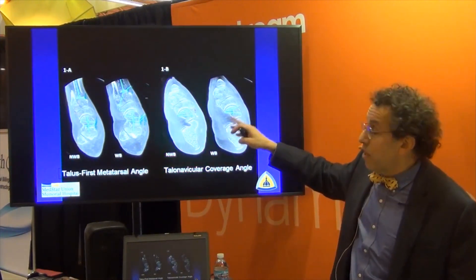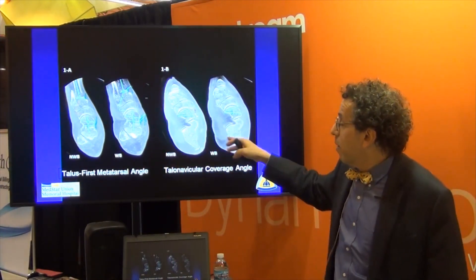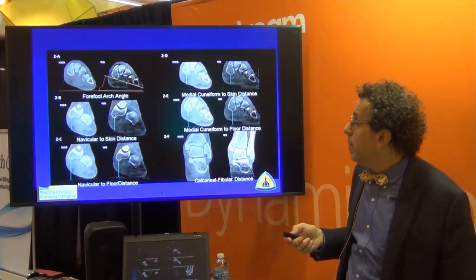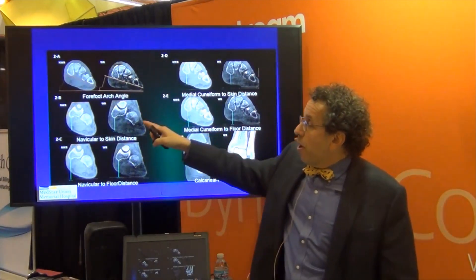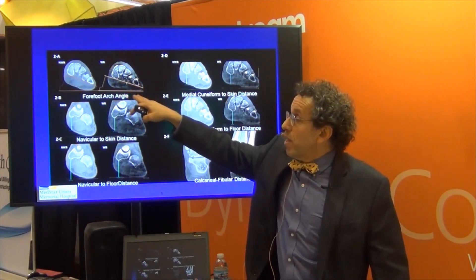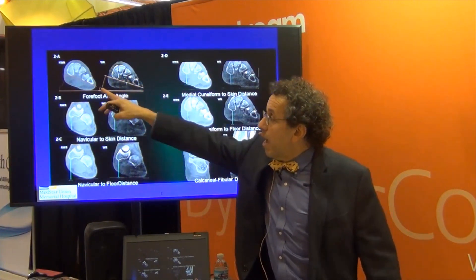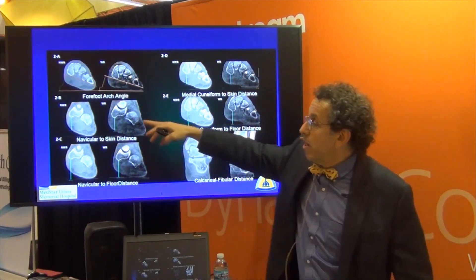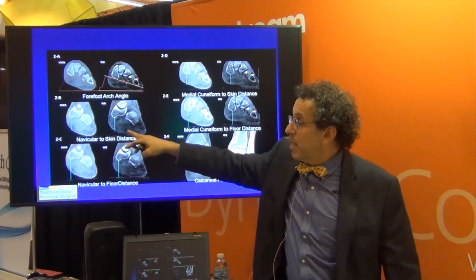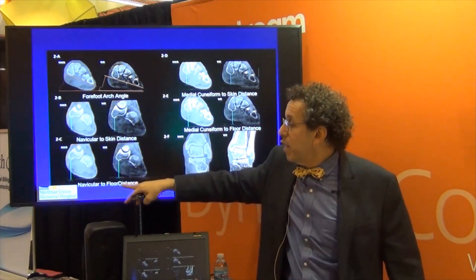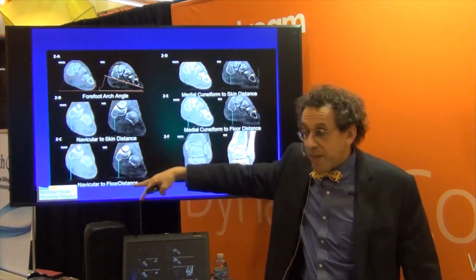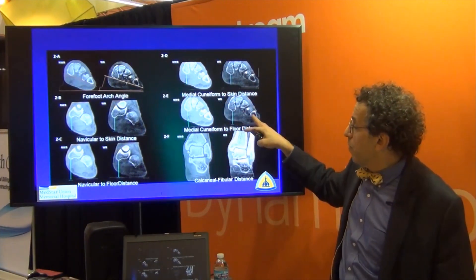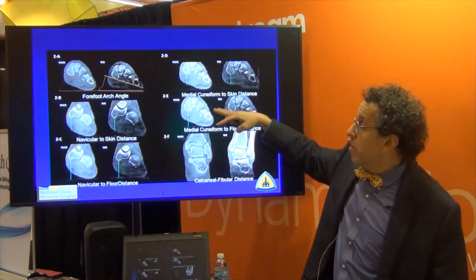Talonavicular coverage is another common thing we look at on x-rays, and now we can examine it on CT scans in a three-dimensional format. Forefoot arch angle looks at the angle of the arch relative to the floor — non-weight-bearing versus weight-bearing, you see it's lowered, consistent with a flat foot. Arch height, navicular to skin distance, and navicular to floor distance all drop with weight-bearing, as do medial cuneiform to skin and medial cuneiform to floor distances — all captured on the weight-bearing CT.